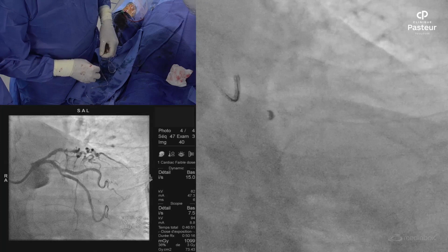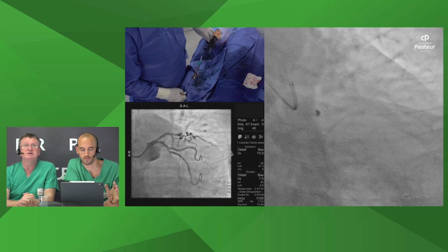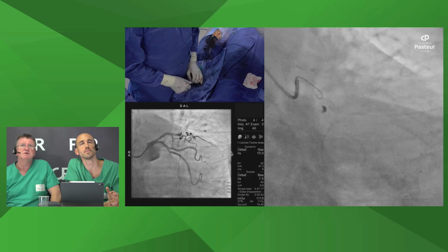The audience asked if there's a concern about LSD, longitudinal stent deformation, with guideliners. The answer to that is yes, but maybe it is something that you have to do. Any passage of any equipment through a previously deployed stent can be associated with LSD events, so it doesn't have to be the guideliner. The stents, the balloons, they can all cause LSD events.